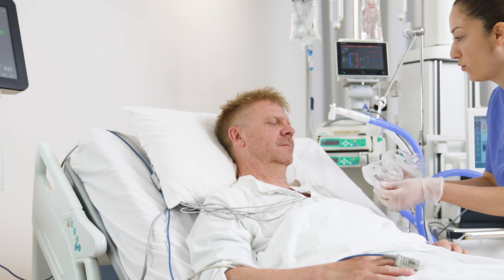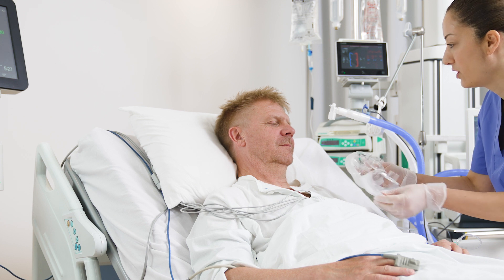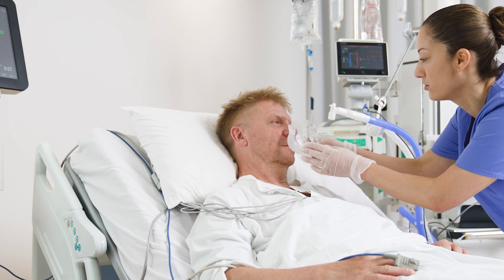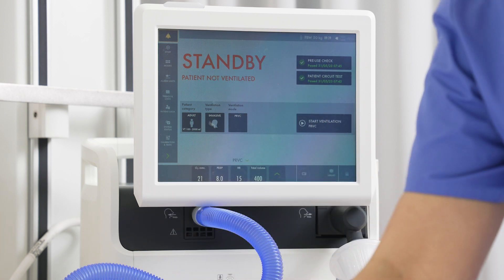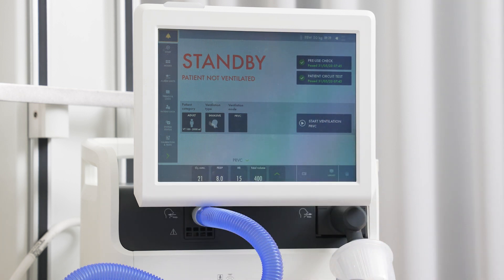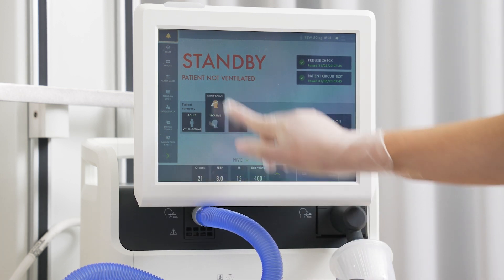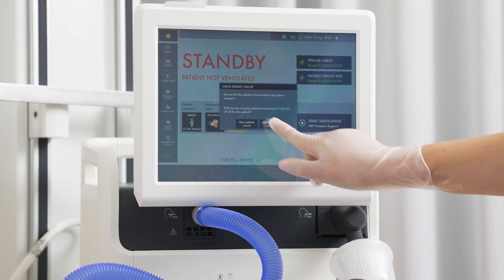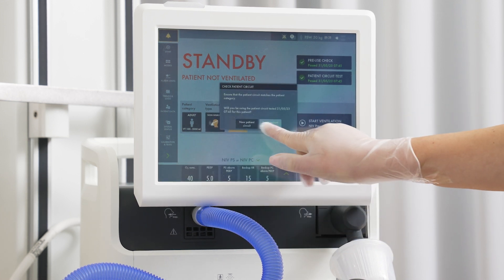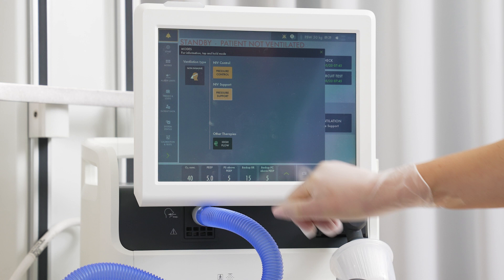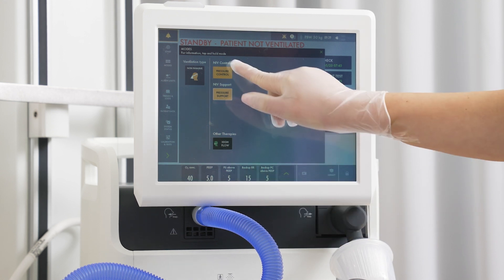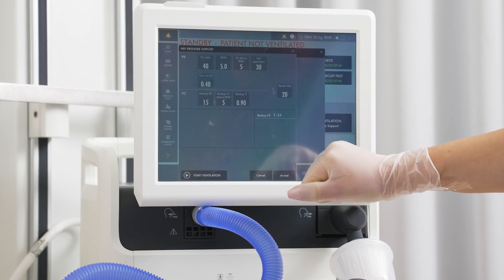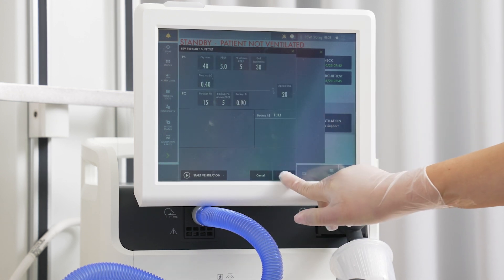Choose the correct patient interface and inform and prepare your patient. Then choose ventilation type non-invasive. Tap the ventilation modes and choose the mode you wish to use for your patient. Here we will choose pressure support, which also includes CPAP capability.